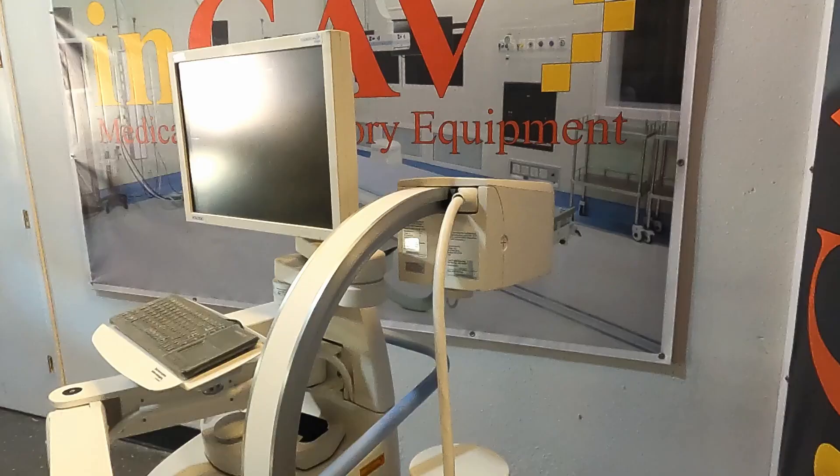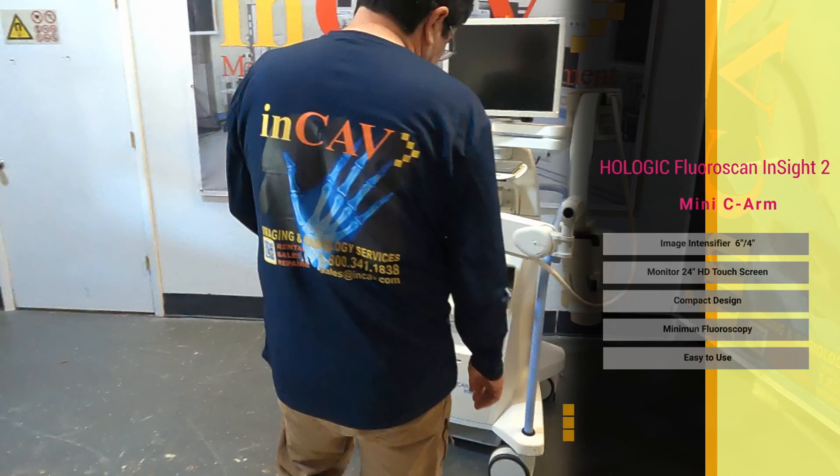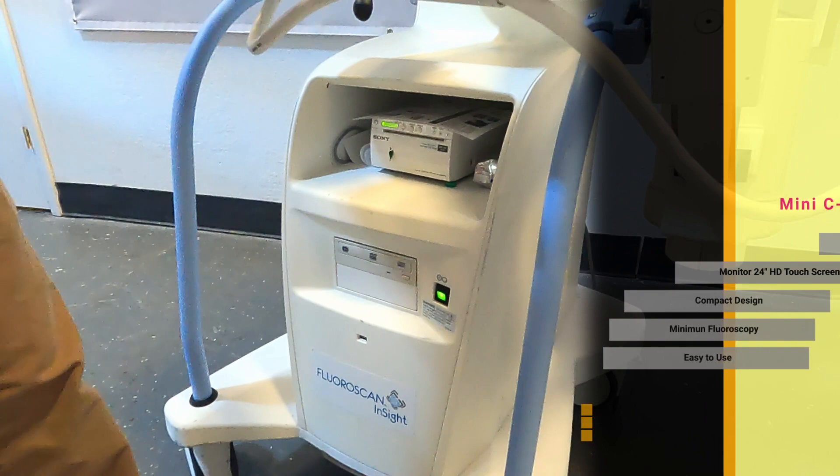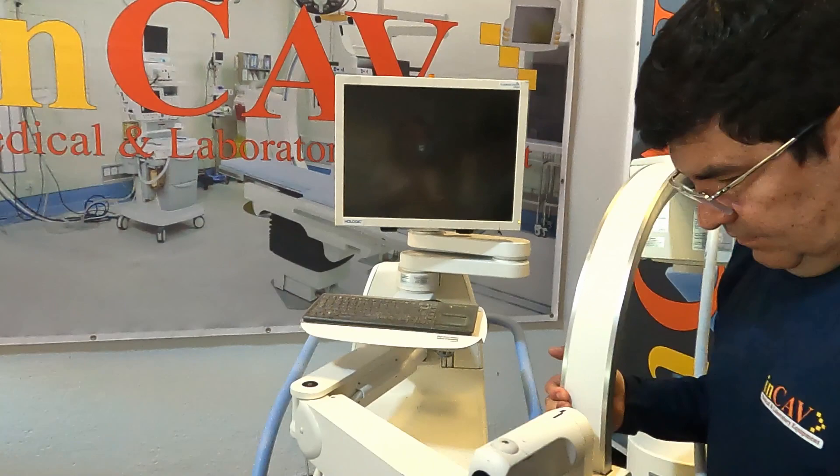The Fluoroscan Insight 2 Mini-C Arm is an intuitive, easy to use system designed specifically for the orthopedic and extremity imaging market. With high quality digital images, simplified operation, and easy mobility, the system is the ideal choice for the operating room, emergency department, doctor's office, surgery center, and sports medicine facility.